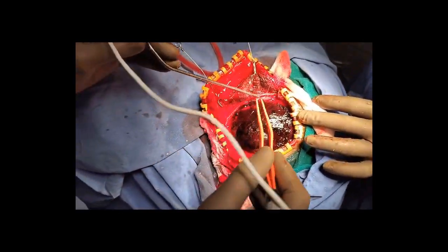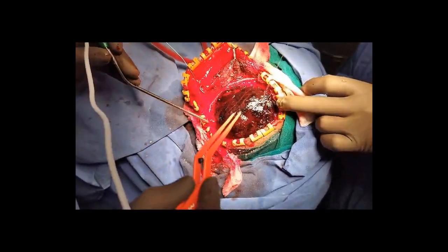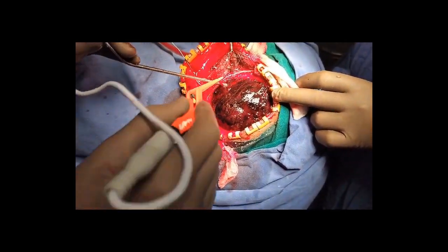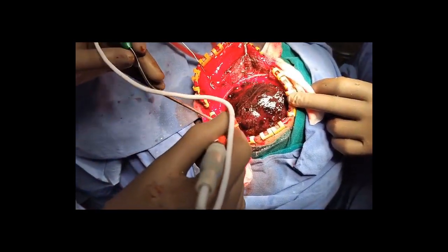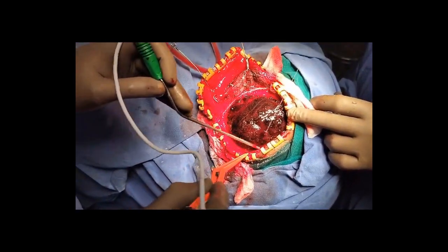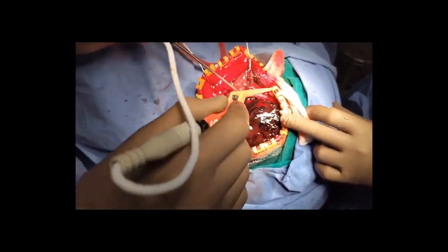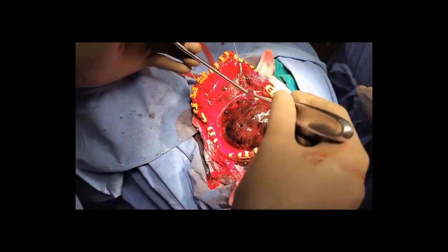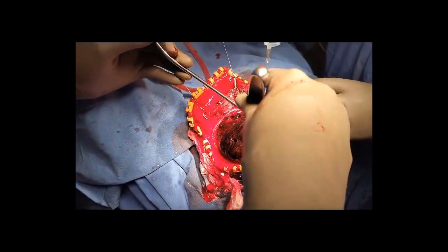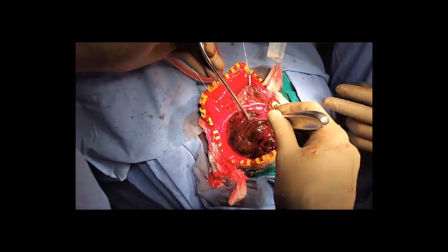After the craniotomy was done, you can see a huge extradural hematoma, which is almost an organized one, because this patient had something called a lucid interval. He fell down, became conscious, came home, and again slipped into unconsciousness. Relatives thought that he was under alcoholic influence. Later, he was taken to the hospital where they diagnosed him to be having a severe head injury.